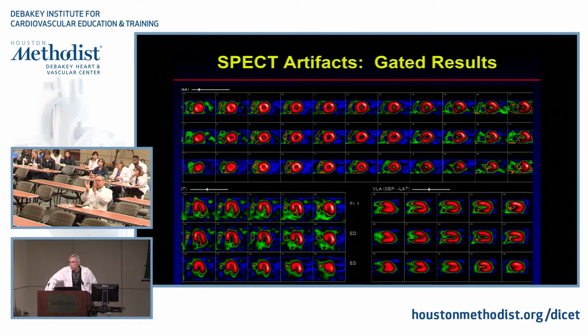So being in the sitting position, would that actually reduce this artifact? No, the same position doesn't. Actually, you have to change the position, because when you lie down flat, your diaphragm tends to come up. Right. If you're sitting in a chair, that can somewhat help, so upright imaging can also help in terms of lowering the diaphragm.